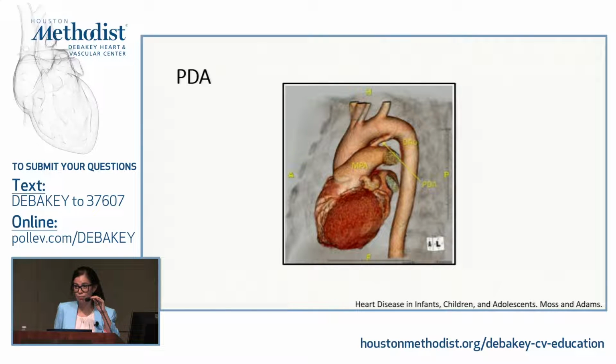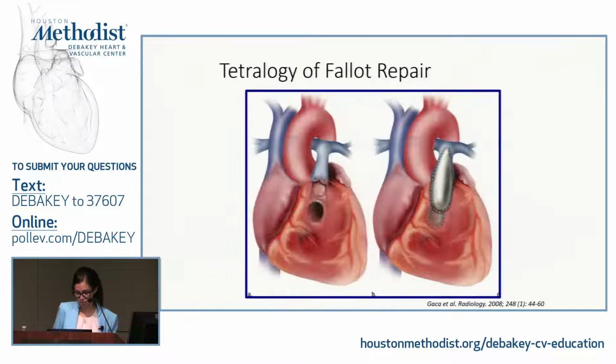Instead of using the pulmonary artery forward flow for your QP, you will use the aortic forward flow, and in the denominator, you will use the pulmonary artery forward flow. This is just because of where the shunt is, right? So it's not accounted for at the usual places where you measure the flow.